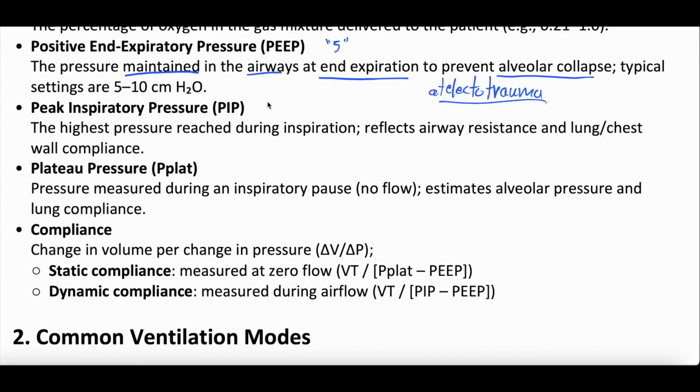All right, the peak inspiratory pressure. We actually have a dedicated video on peak inspiratory pressure and plateau pressure, so this is not going to be a deep dive like that was. Again, check out the playlist. Sorry, our allergies are getting us today, but check out the playlist for a detailed dive. But the peak inspiratory pressure is essentially the highest pressure achieved during inspiration.